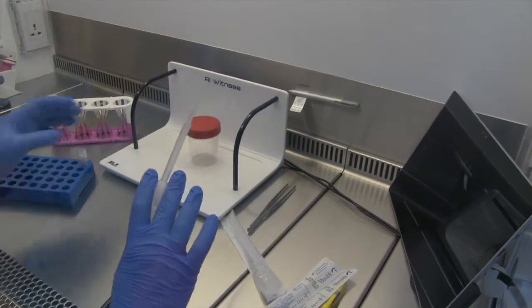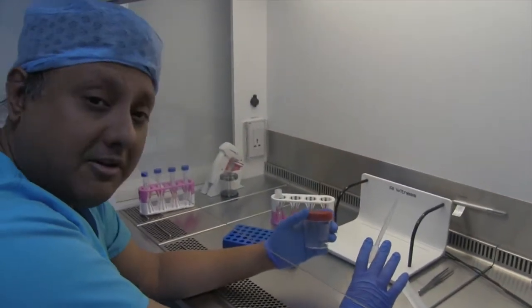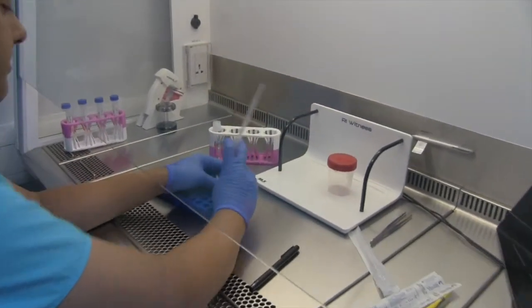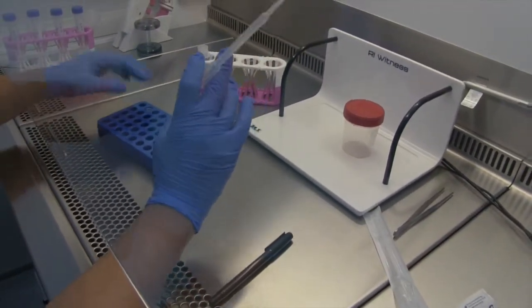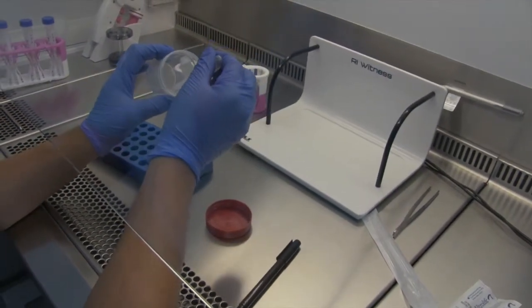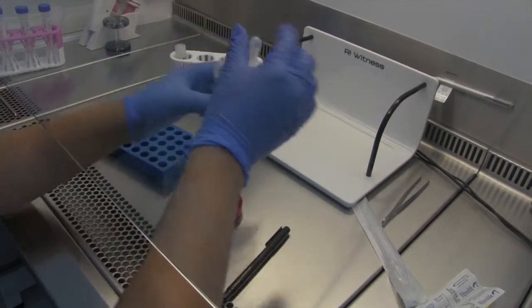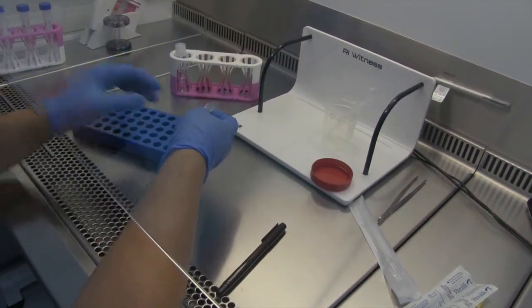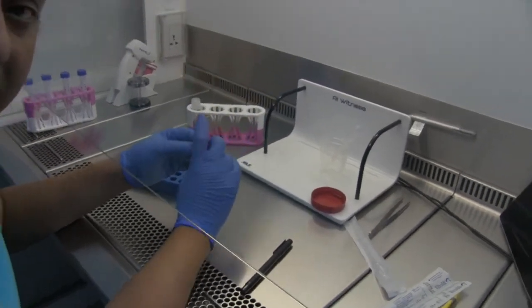After 10 minutes, when the sperm and the cryomedia have had time to equilibrate — and the cryomedia has had an impact on dehydrating the sperm — you would open your vial, or multiple vials. If you have three mils, you would load your sperm-cryo mix into the vial, close the vial, and now it is ready to be vapor frozen.